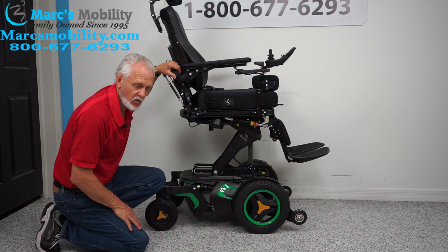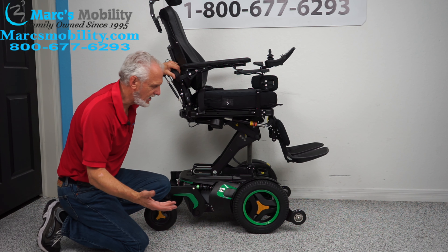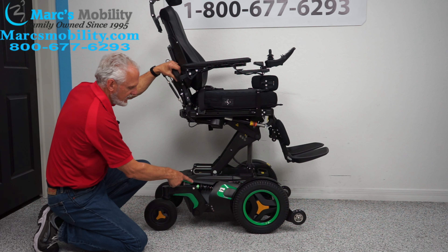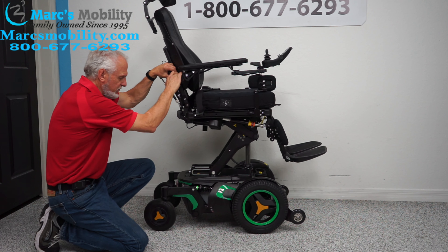This chair weighs 425 pounds, so with another 200-pound person it's going to be over 600 pounds. This chair will give you an amazing ride. Just because it's heavy, it has all kinds of suspension. If I push down on the chair, you can see the suspension working in the back.